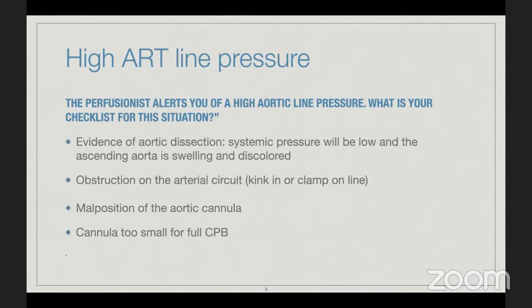He told me about this story. Once he put his cross clamp, he clamped the tip of the cannula. So you have to make sure that the tip is toward the arch, and this is something that can happen if you forget. Thank you. That's a very good point he mentioned.